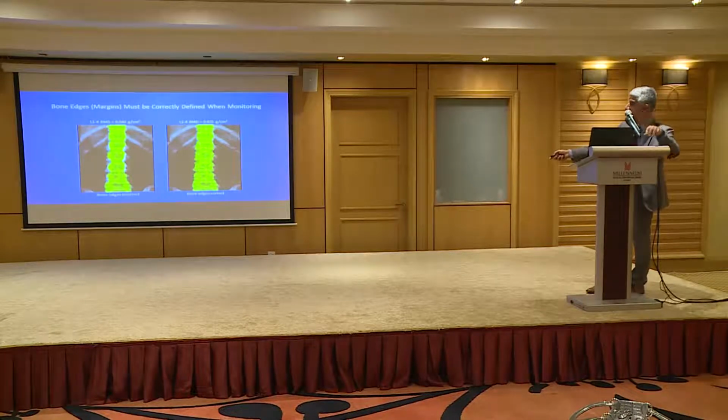You see here, they did not really get them correctly. There's some bone left over. And this is done correctly. Okay? So it gives you a different value if you do it correctly.